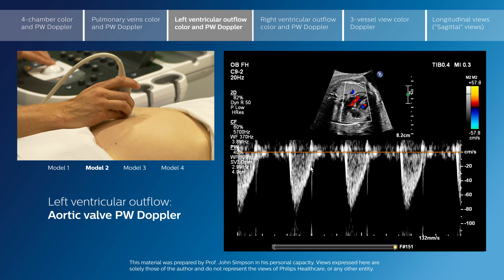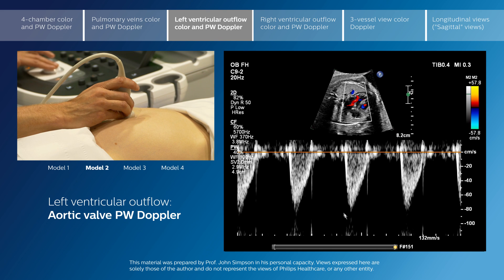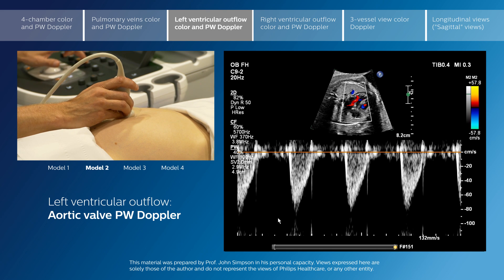In this particular fetus, the Doppler velocity is around 80 cm per second, which is normal. In most fetuses, the Doppler velocity will certainly be below 100 cm per second, except occasionally in late gestation where the velocity may slightly go over 100 cm per second.